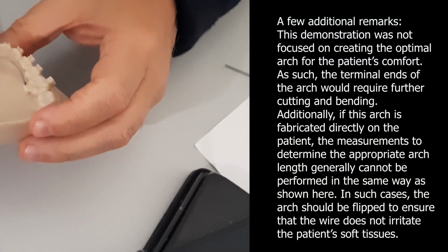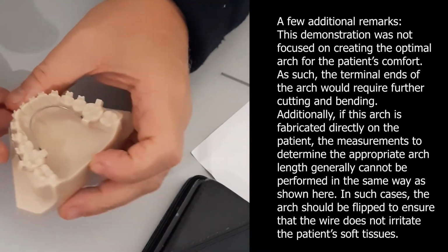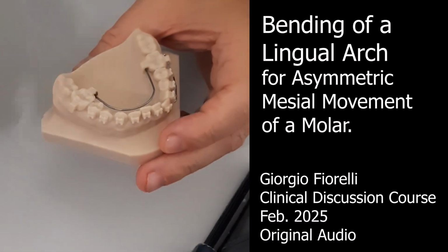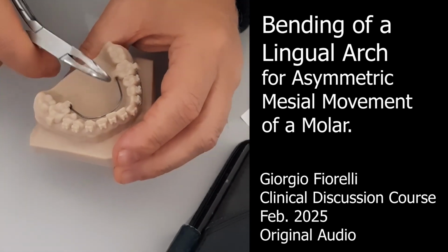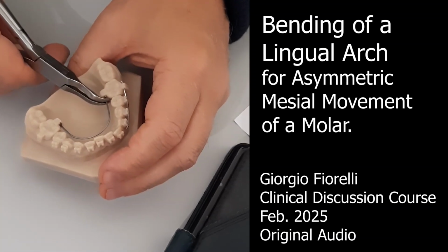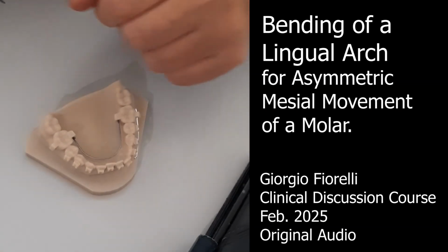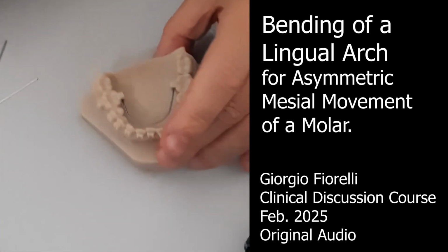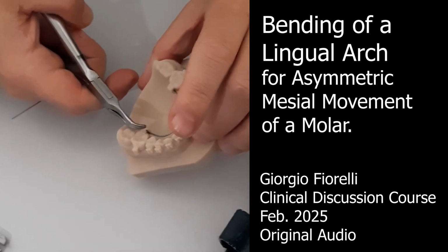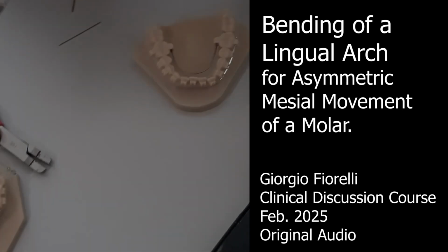And after the movement is complete, the next reactivation would be to make a new lingual arch? No, you can adapt this one. I would never do it again. This is just a matter of this part being blocked by the TAD or whatever. And here you do another bend out. Again, you will have to check the neutral position for transversal and rotation, and you go on. But this is already moving the molar a couple of millimeters. I thought it would again touch the incisor. When you raise the molar, you raise it. Oh, okay.